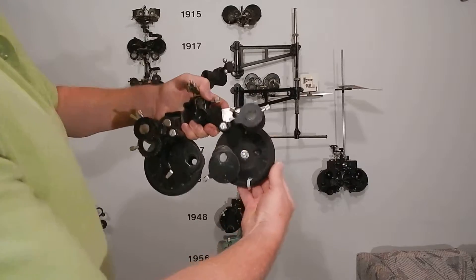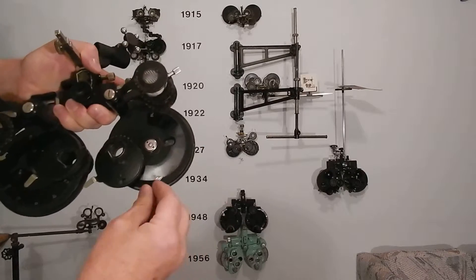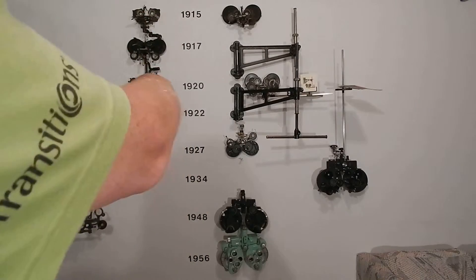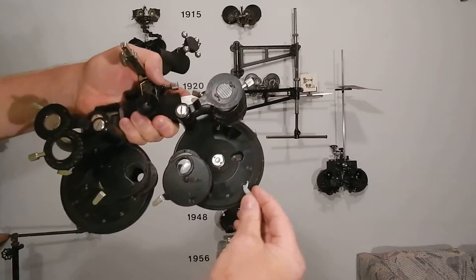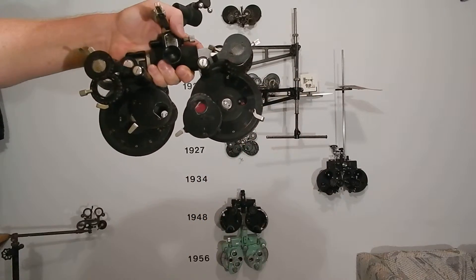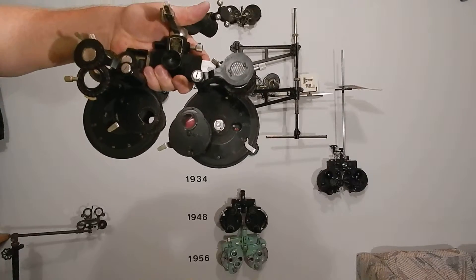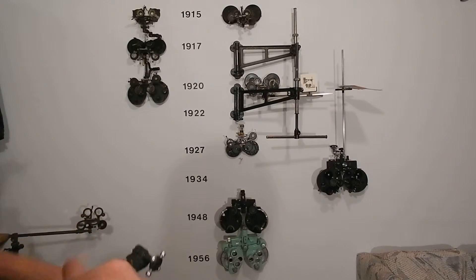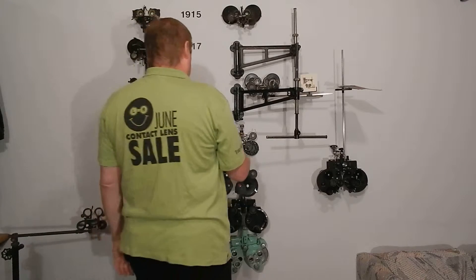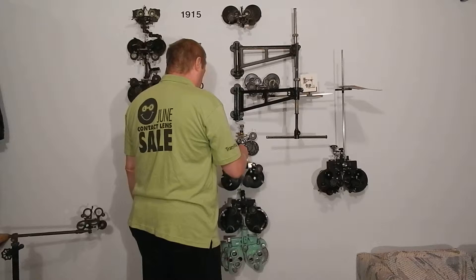It has three discs instead of four, and the front disc is readable from the front — you don't have to read anything from the back, unlike all the earlier models. They were trying to compete with the Green's refractor. This is the additive effective-power phoropter, which came out in 1934, the same year as the Green's. Then the Depression hit and World War II started — nobody was buying phoropters anyway.